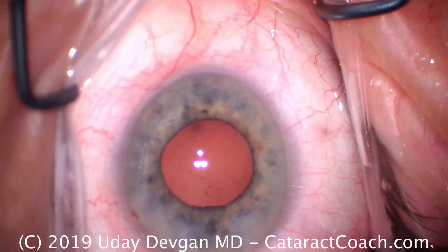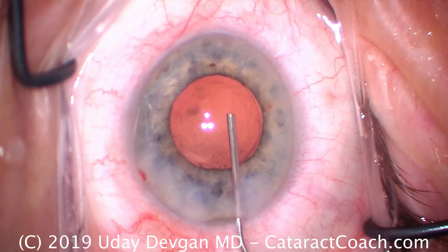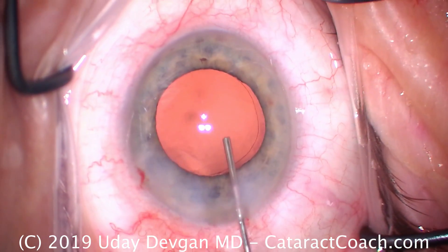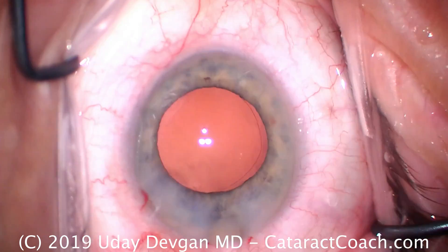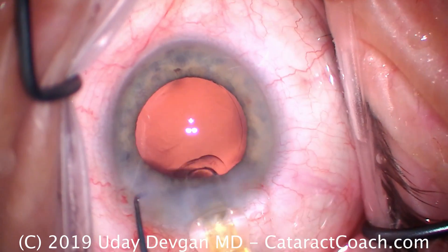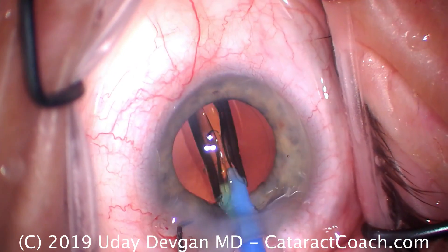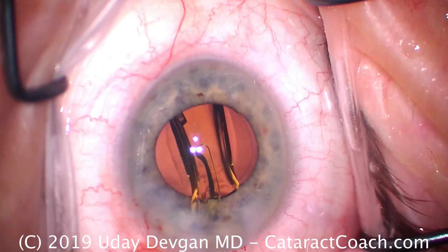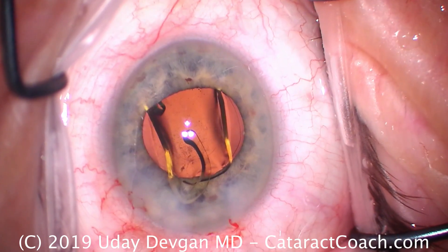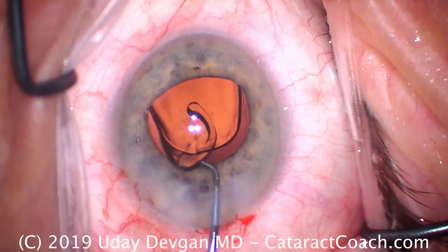Let's fill our capsular bag with our cohesive viscoelastic, then we'll put the lens in. And I'm going to figure out the answer right about now — watch carefully. There's the capsular bag inflated, there's the rhexis, everything looks nice. As I go to put the lens in, I'm going to fixate the eye with the chopper. And as I do that, the chopper slips out. Put it back there again, let's get that lens in. What's with the chopper tip? Now it hits me — oh, that thing is broken. The chopper tip is broken. That's the issue.